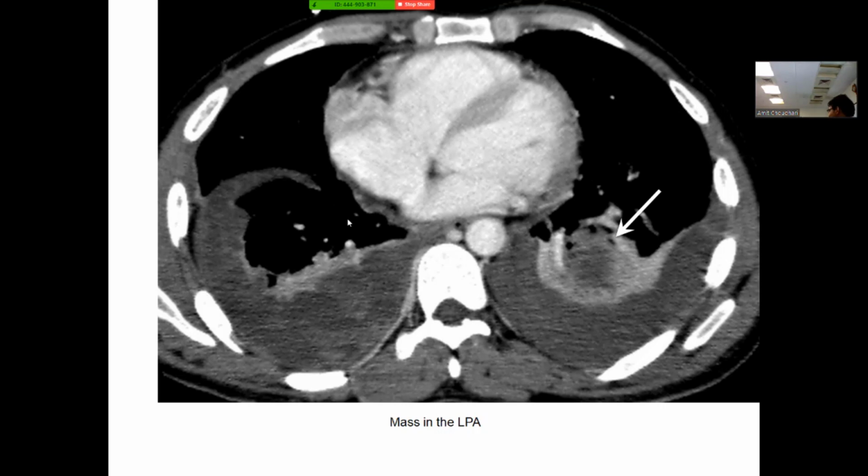Okay. So is there any role of MRI? Somebody asked me, we don't want CT and we only want MRI. Chronic pulmonary thromboembolism. Can quantify heart function. Intracardiac thrombus. Got it. CT pulmonary angiography is contraindicated or relatively contraindicated. Pregnancy. Right.